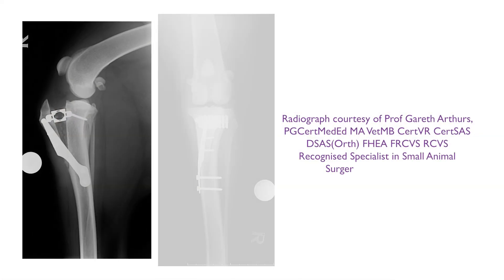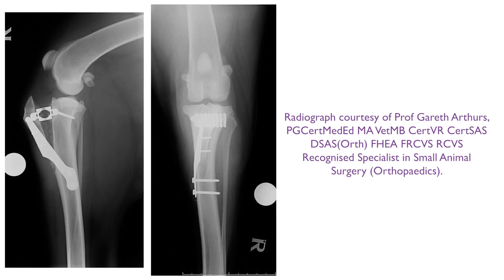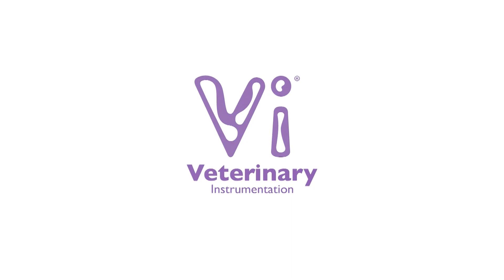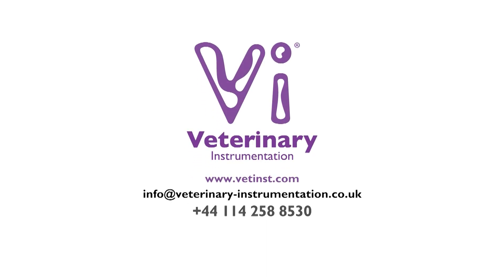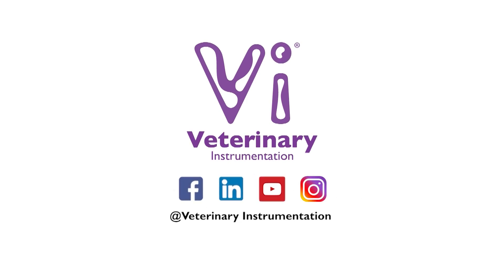Post-operative radiographs must be taken following closure of the joint capsule and soft tissues. For further information on the VI range of instruments and implants for TTA surgery, please visit our website or contact our specialist technical support team. Join our online community by following our social media pages, keeping up to date with the latest releases of training and education material, as well as company updates. Thank you.